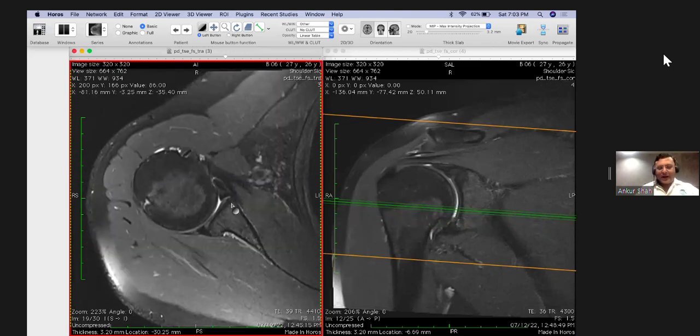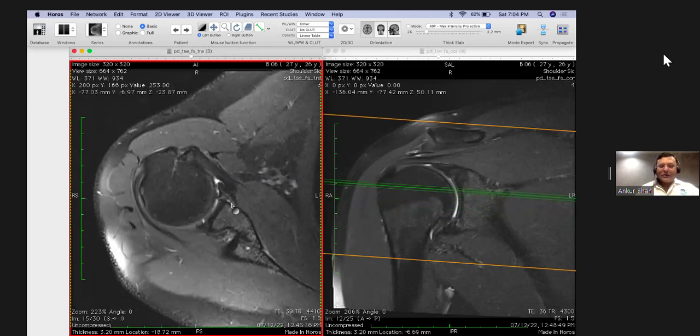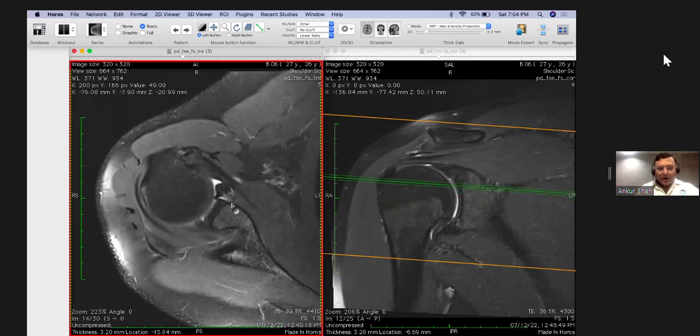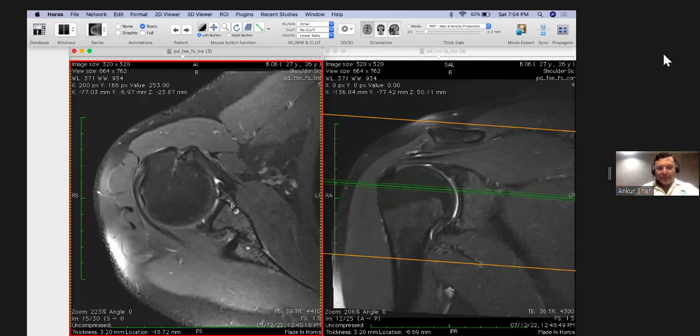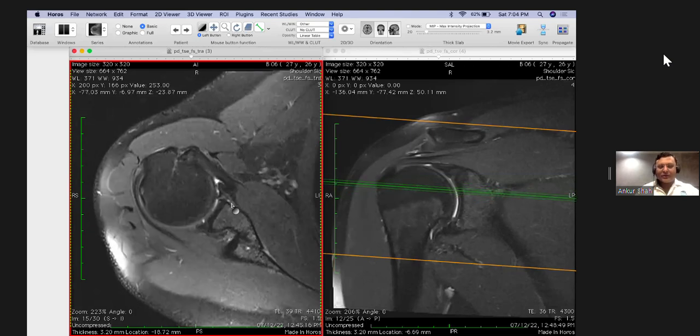So many of the times, this patient may not clearly give you a history of shoulder dislocation. They might have some history of a jerk or some injury in the past, probably some months before. So there are no acute changes, but the changes might have happened some time ago. And go back to the superior part of the head of the humerus, which is the classical location for the Hill-Sachs fracture.